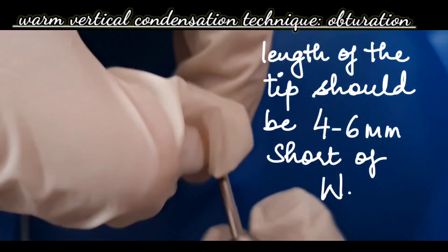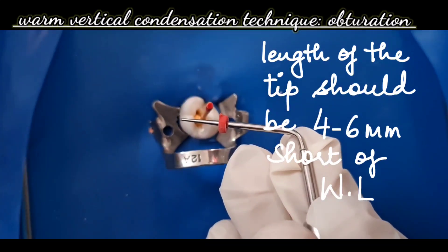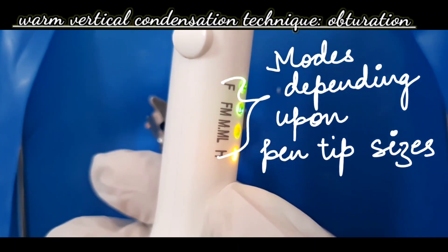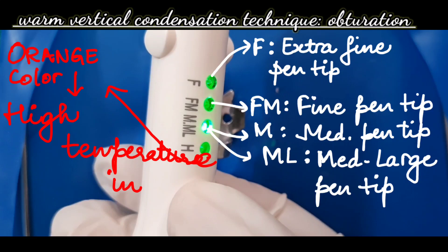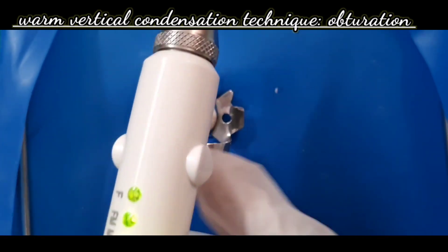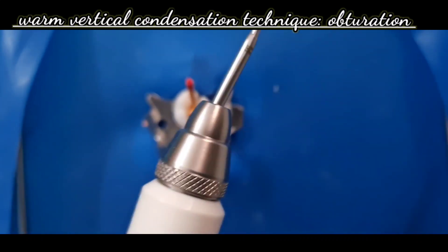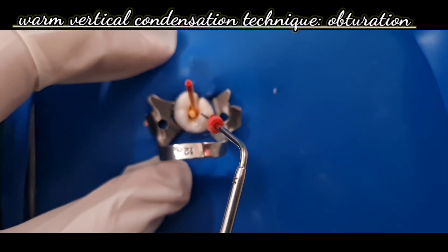The length of the pen tip should be 4 to 6 mm short of the working length. Mark this length using a rubber stopper. Select the proper pen tip and plugger accordingly. There are different tip size modes: F for extra fine, FM for fine, M for medium, and ML for medium-large. The heat button is held to start heating the tip — a beep will sound — then release the heating button to stop heating and the beep stops.